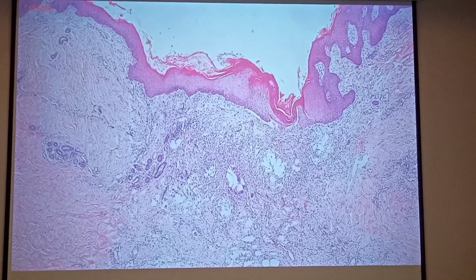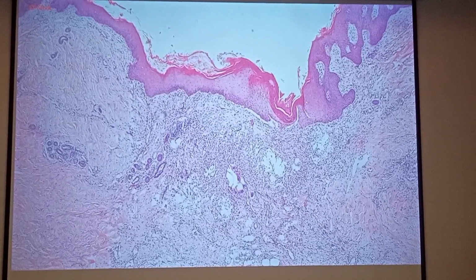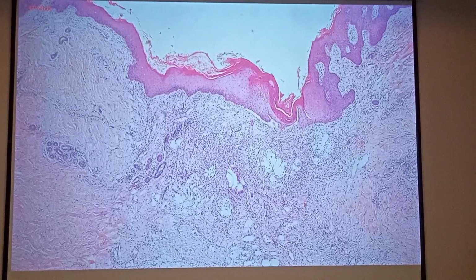The continuum is restored right there. So essentially the epithelium has renewed itself, and I think the original wound was somewhere here. But I think the wound healed by primary intention because there's not much damage, and there is reconstitution or restoration of the original epithelium right there.